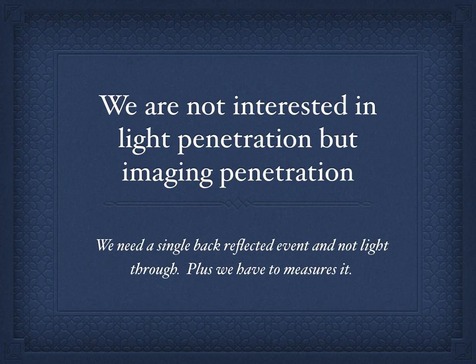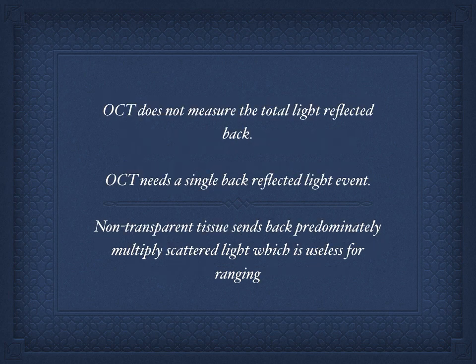If the photon goes in, hits the mirror, bounces around 3 times, and comes back, it has a longer time of flight. So when you look at the image, you'll have pixels filled with backscattering that looks like the light is penetrating into the mirror. So it's a fake out. The time of flight is longer than the distance of a single scattering event. This is called multiple scattering, and it also reduces resolution. So you're losing those photons, and you're widening the point spread function or reducing resolution. We'll come back to this numerous times because it's critical.